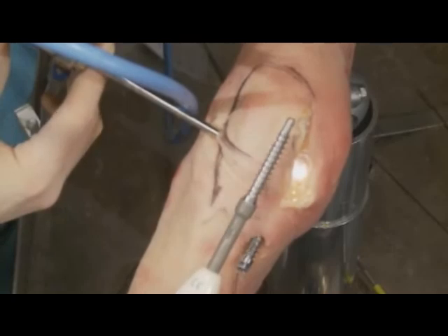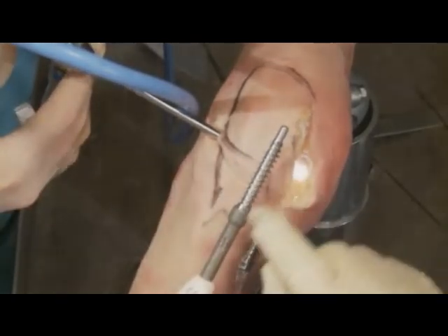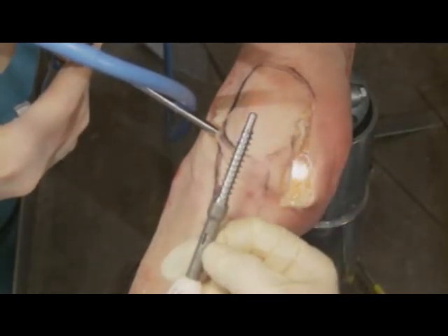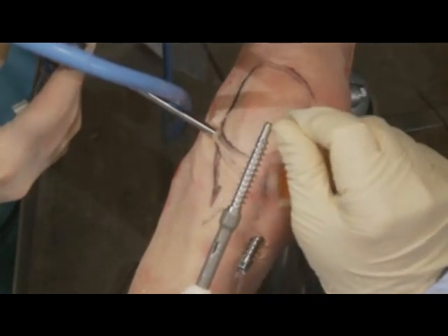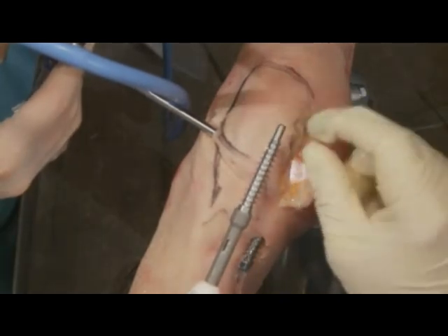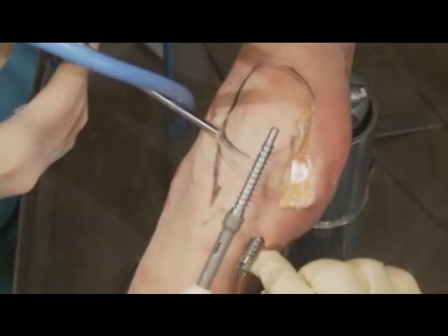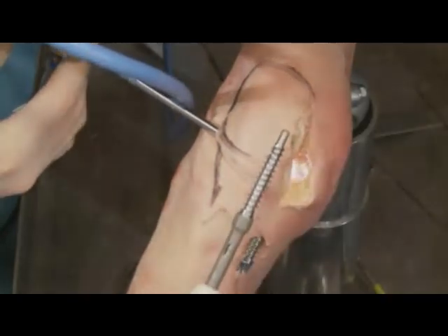So this is the construct that we need to put into the tibia. And you can see here, right here in this little fenestration, there's a line that lines up. And once that line is lined up with the screwdriver, you can see the depth of the rod, the depth gauge that we put in, and this is where the top of the joint is going to be. There's an area here that's cut, and that's the width of the tibial implant that we're going to put in. So once this screw is set in place and it sits into the joint, then we know the depth of the screw we're going to cut.